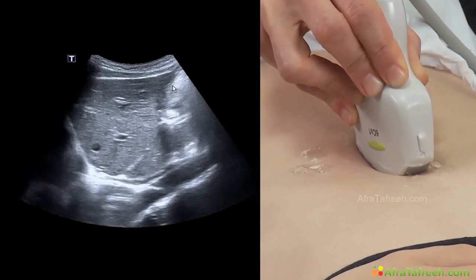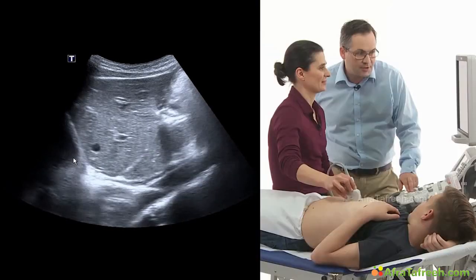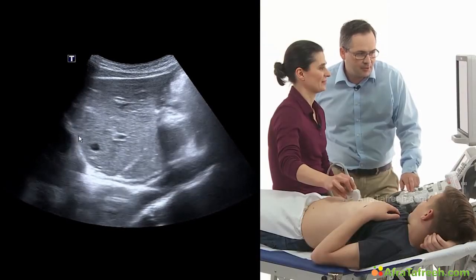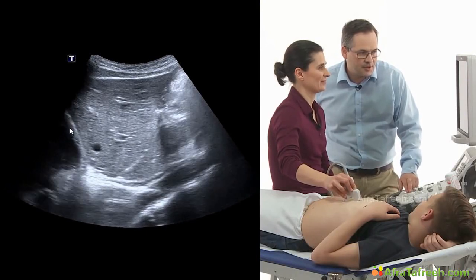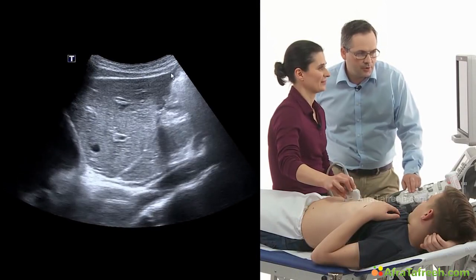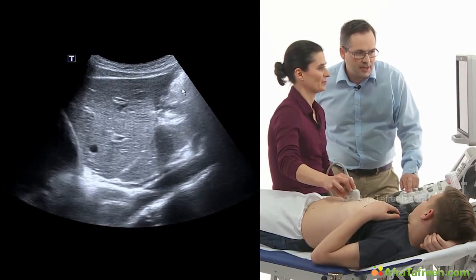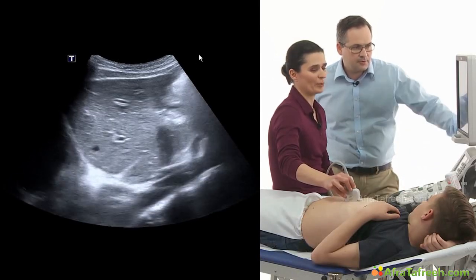Fine. We see the left liver lobe. Very beautiful over here. On this side there's something moving. It's the patient's heart. So the cranial portion of this screen we see the diaphragm over here, left liver lobe, and the caudal border in contact with the gas-filled stomach over here. We let our patient breathe again.